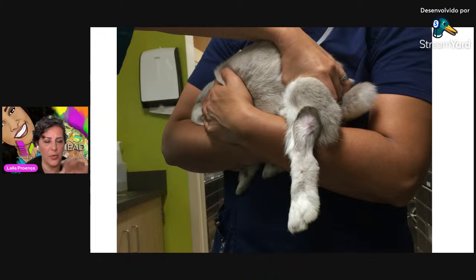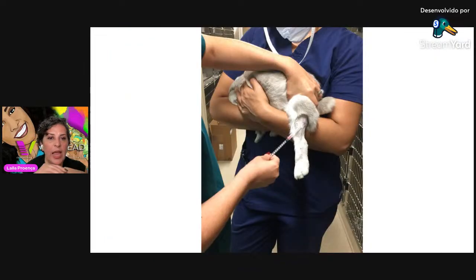I don't want you to be afraid of that. It can happen, but it's not that common if you do it properly. So again, you are going to do that. And then with your right hand, in my case my dominant hand is the right, I am going to collect the sample.